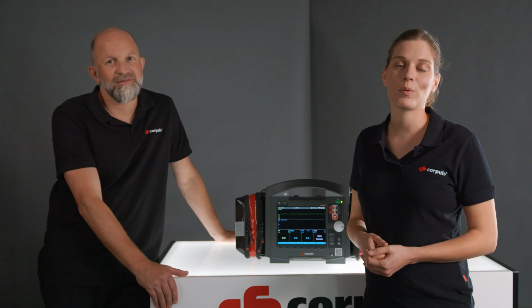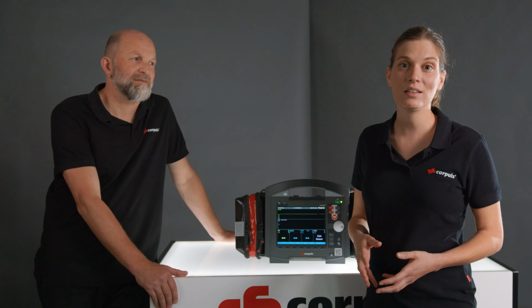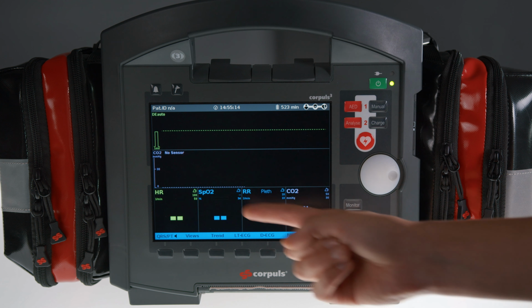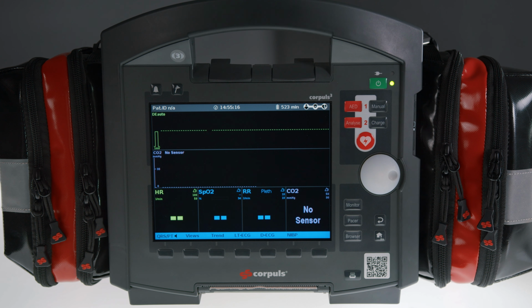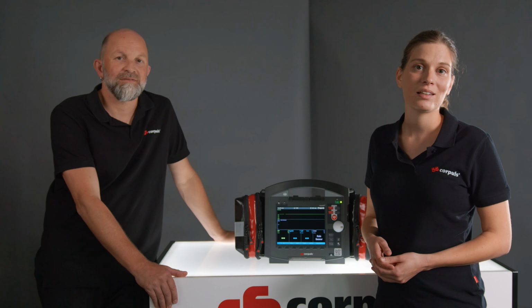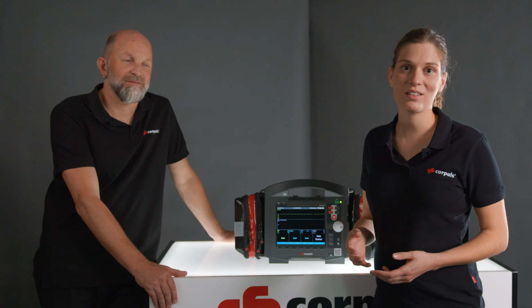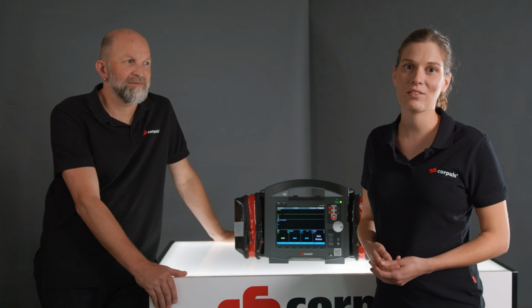Another change to the daily function test can also be found in the capnography area. If the message "no sensor" appears on the display, even though we have connected both the CO2 master cable and the sensor correctly, it can be assumed that there is a cable defect and a replacement should be made accordingly. Very importantly, do not unplug this cable during use.